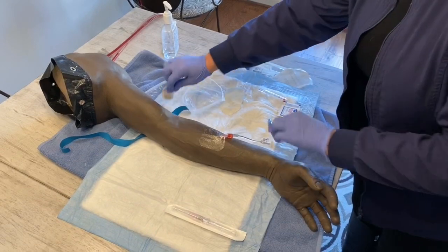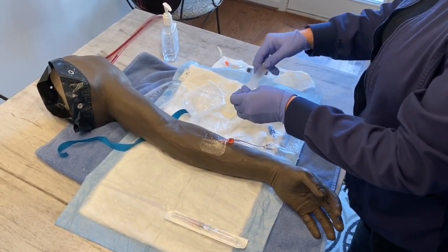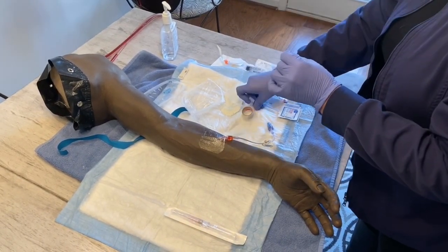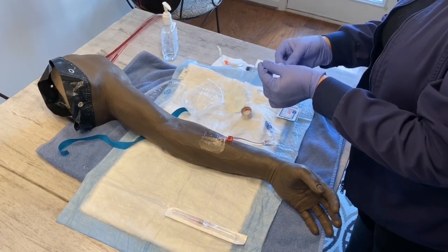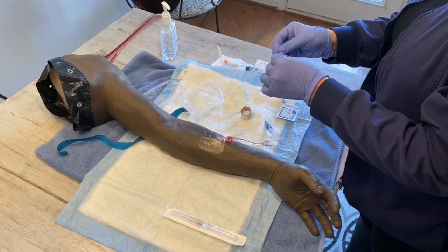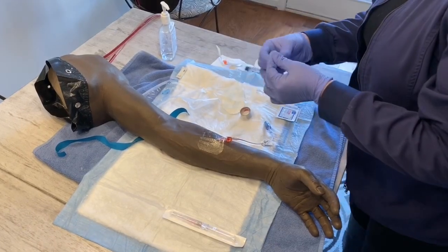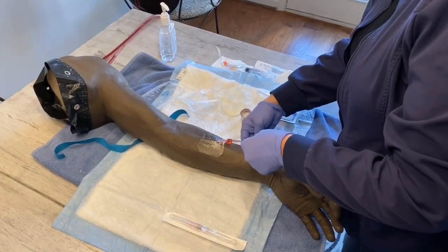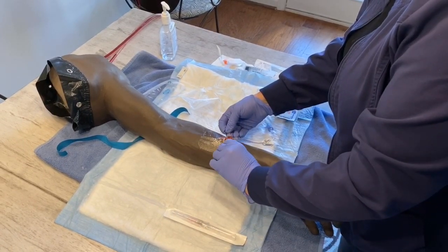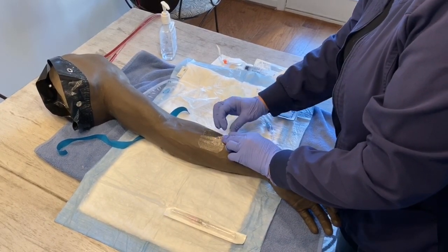Now, you want to then secure it even more so that they don't lose the site that you just stuck. So what you need to do is use the tape that comes in the kit itself. Do not use hospital tape. Do not actually put tape across the site before you put the Tegaderm on. Evidence-based practice has proven that this creates an actual infectious site. I like to take the tape that comes out of the kit, I go up underneath it with the sticky side up, and then I call it a chevron where I go up with a U onto the Tegaderm.